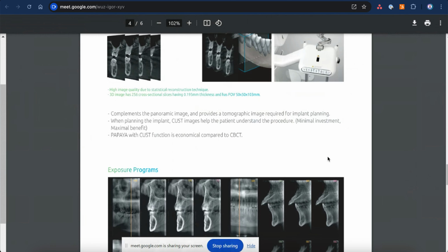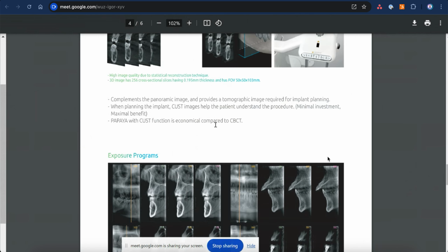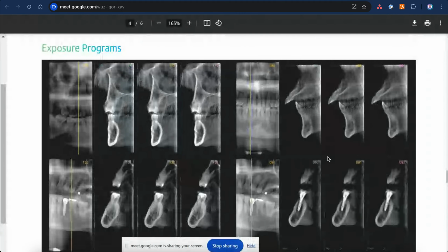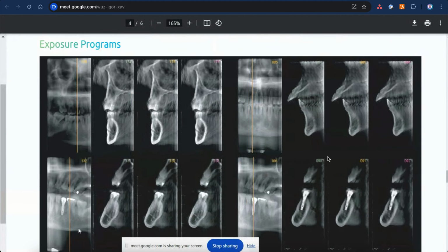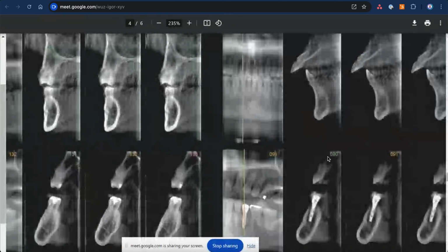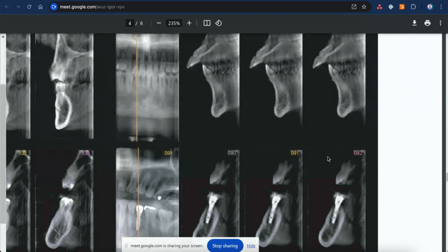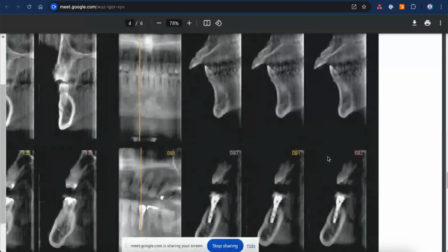So this is the device that also gives the tomographic image. This is the exposure. Yes, for example, here. Can you see the cut in the orange color? For example, I want to cut here. He's doing the cut, like 132. Then this image appears. Then he can move here, for example, this one also, the 91. This thing that has appeared is the implant. I can see that it's correctly positioned in the mouth and inserted correctly in the bone, and the gum here is good. That's exactly what it's used for.